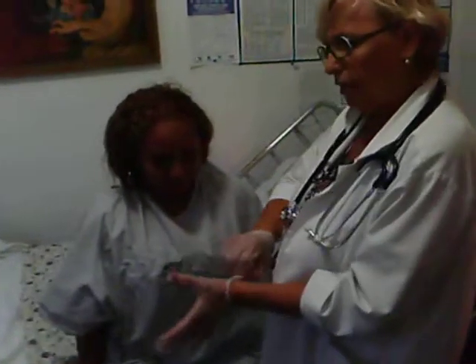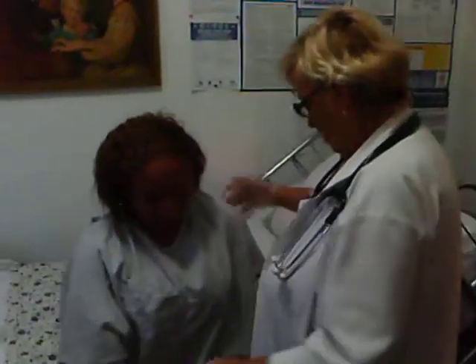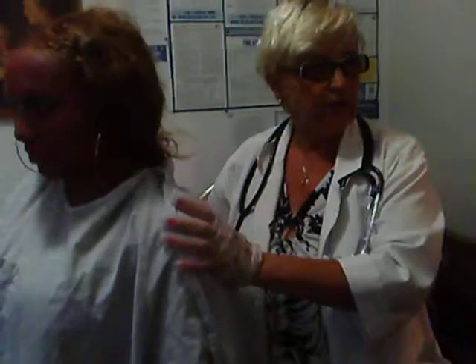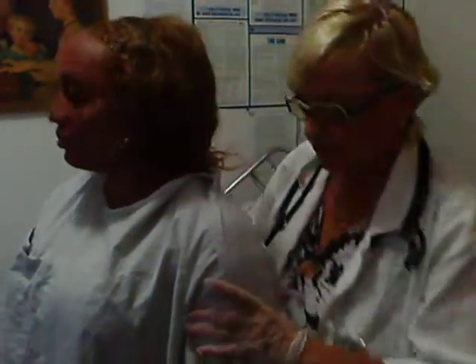Now we are going to go towards the scale. Can you stand up for me? The patient can stand up and walk — no problem. The critical part: you have to overlap the patient's back with the gown. Okay, Mrs. Green, let's go and have you sitting down on this chair.